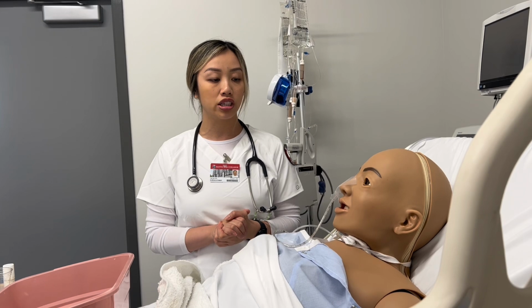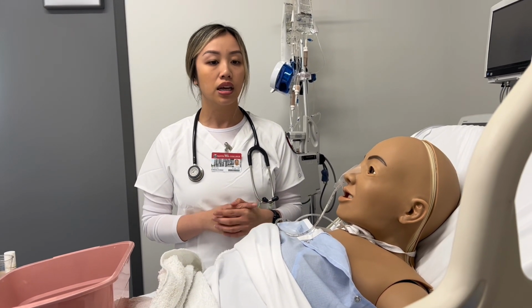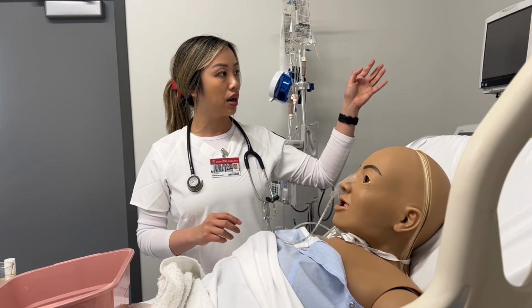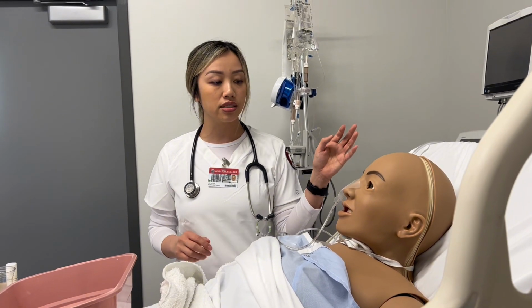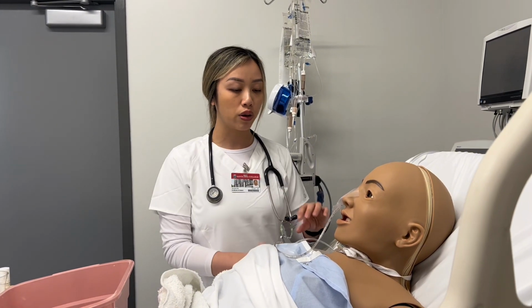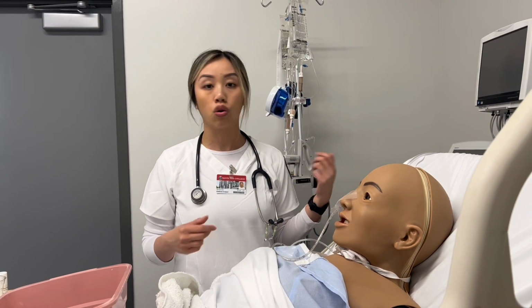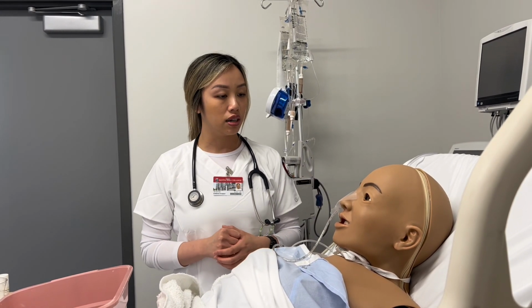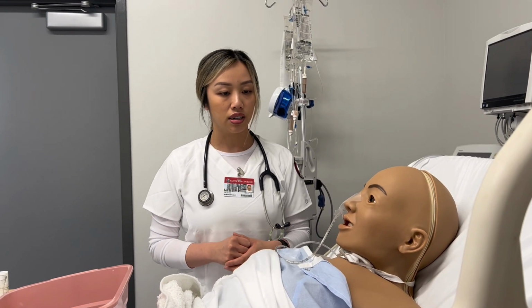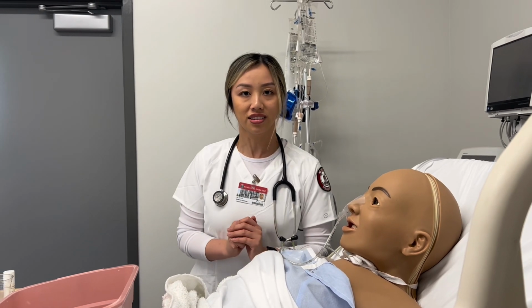So I would document the size of the tube. I would go ahead and document the time, the date, who placed it, the color of the secretions, which nare we're using. So we're using the right nare. It was a 12 French tube. It looks like the secretions are normal right now, which is great. Time and date, yeah, and that would be it. And then that would be the end of that skill right there.